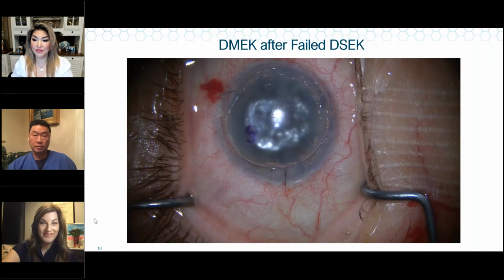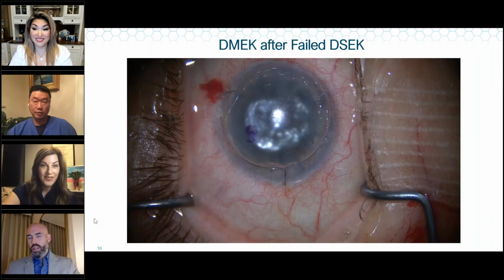All right. Great case. A lot of pearls there, Nicole. Yeah. So with that video still up there, Dr. Fram, what size air or gas bubble, we'll use them interchangeably, do you like to leave at the end of your DMEK procedure?